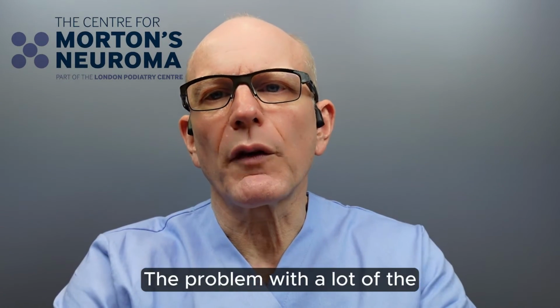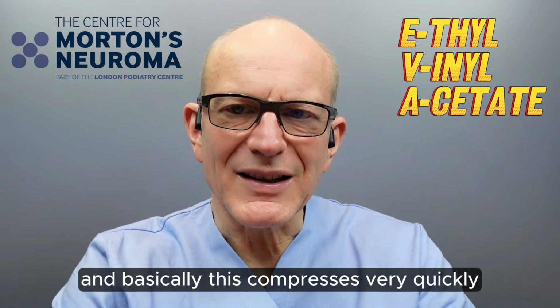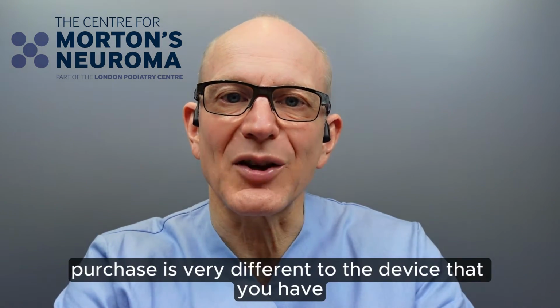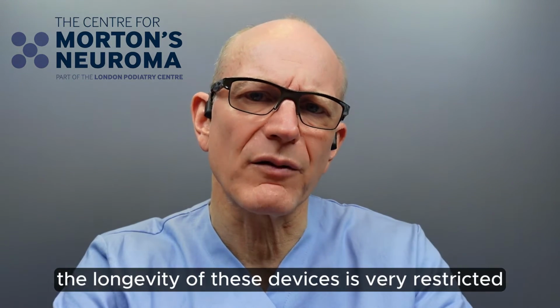The problem with a lot of the off-the-shelf orthoses that you can get is that they are made from an EVA material, and basically this compresses very quickly. So the device that you purchase is very different to the device that you have after you've worn it for a few days, weeks, especially months. The longevity of these devices is very restricted.